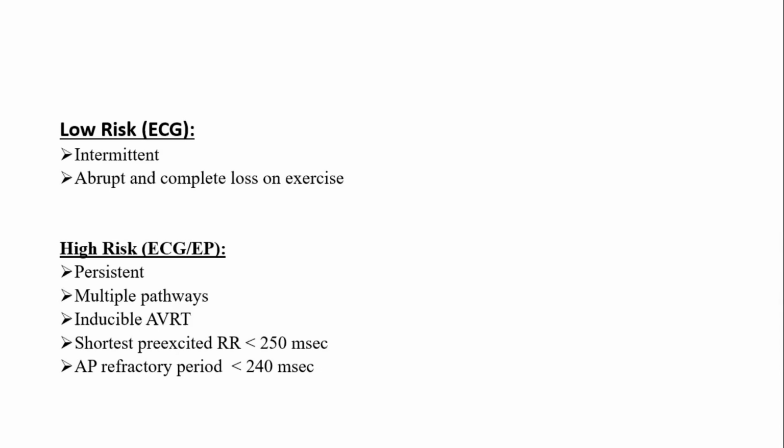But what is the point? This question was asked. ETT was the answer. You are right, do ETT. Obviously, you can do ETT. It's very easy to do and it's available everywhere. So you are right, do ETT.